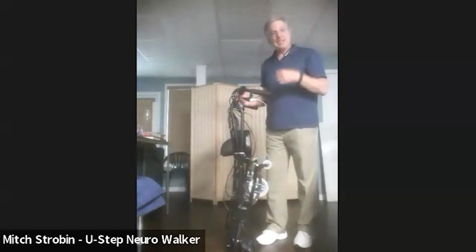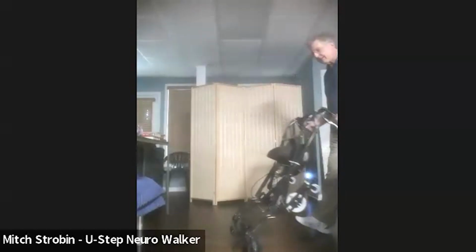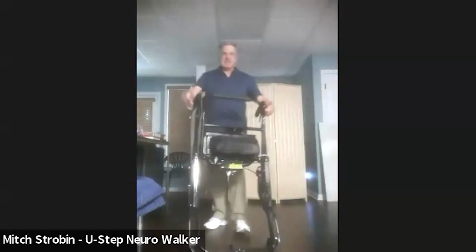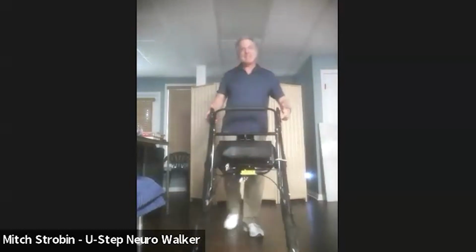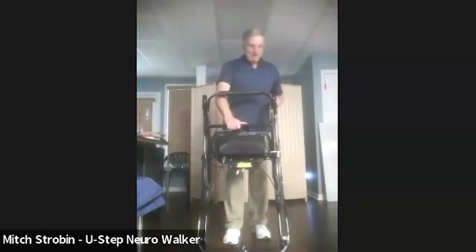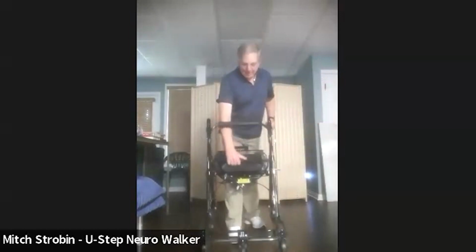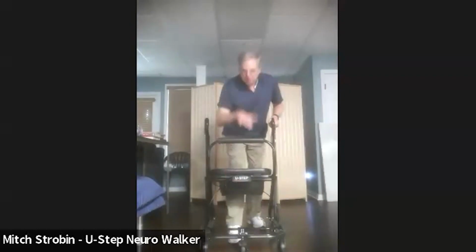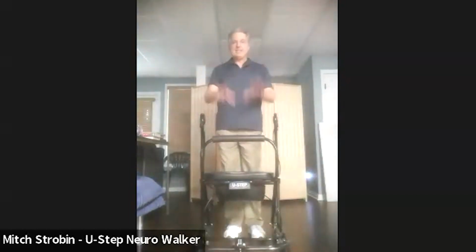So, of course, if we're all strong, we can do that. But an interesting trick I learned from one of these meetings is if I hold the U-step at a 45-degree angle on that front wheel, I don't have to squeeze anything. I'm just using 2 fingers and I can just roll it wherever I need to roll it. So it makes it a lot easier to maneuver when I'm at that 45-degree angle. So let me put the U-step back together. Once again, 30 seconds. That gray clip, unclip it. The U-step will naturally fall into place, and then I push down. That is it.